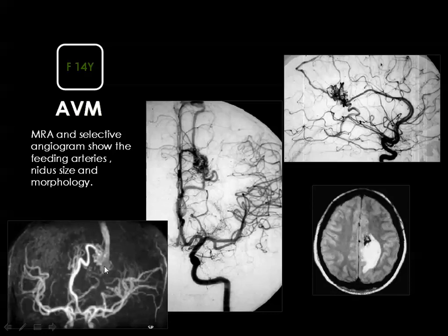And I have to say that the MR angiogram may fail to demonstrate small vascular malformations, but of course the selective angiogram is both diagnostic and may be used for therapeutic embolization of this vascular malformation.